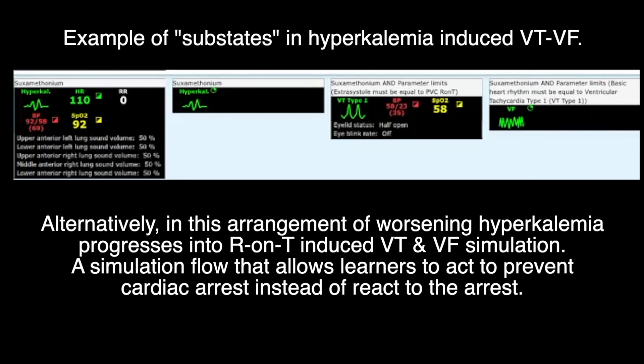Alternatively, in this arrangement of worsening hyperkalemia progressing into R-on-T induced VT and VF simulations, a simulation flow that allows learners to act to prevent cardiac arrest instead of react to the arrest.